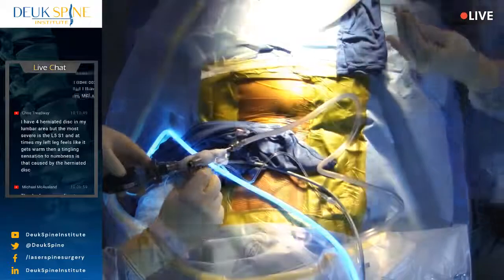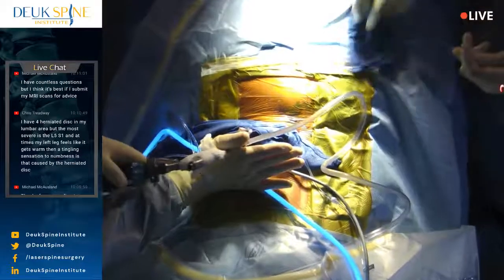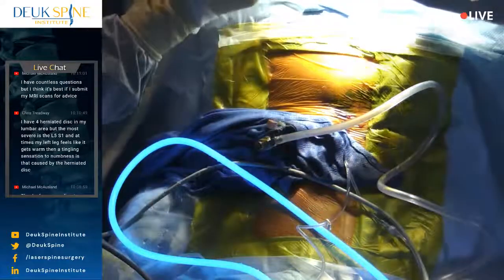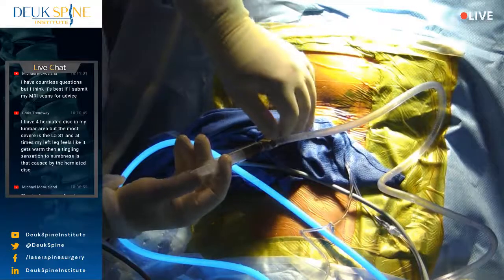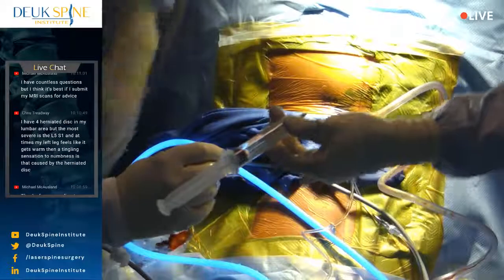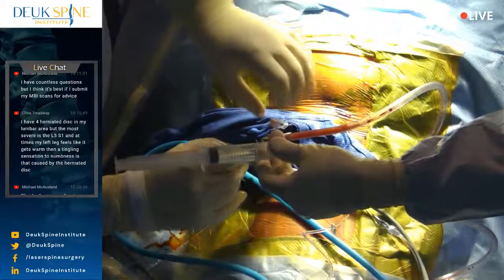Anything beyond this is gilding the lily, which I don't do. We're going to suck out the juices, which is just the irrigation. We've lost probably, I don't know, 10 drops, maybe 20 drops of blood, something like that. Now this is betadine. Betadine is an antiseptic developed by NASA. We've never had an infection from our surgery, but we don't want one.